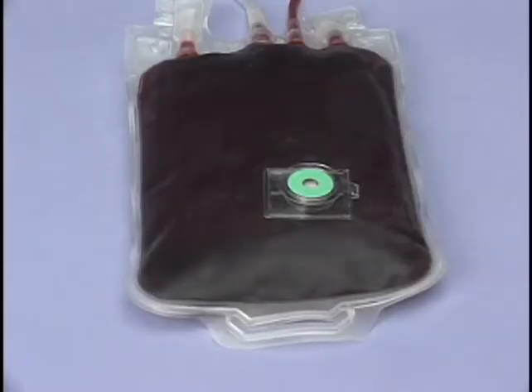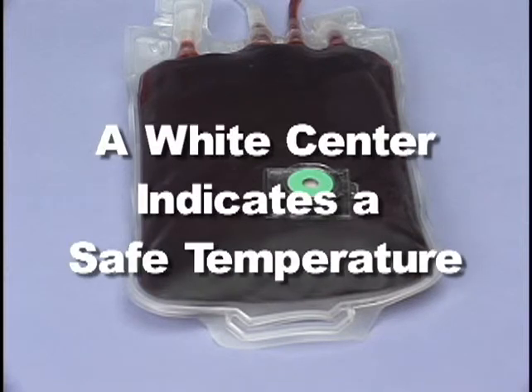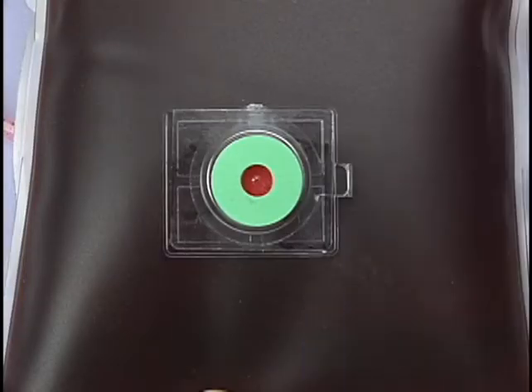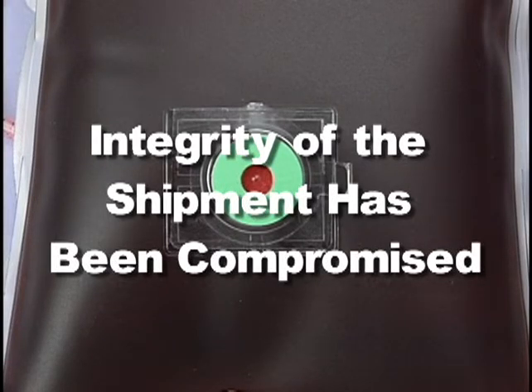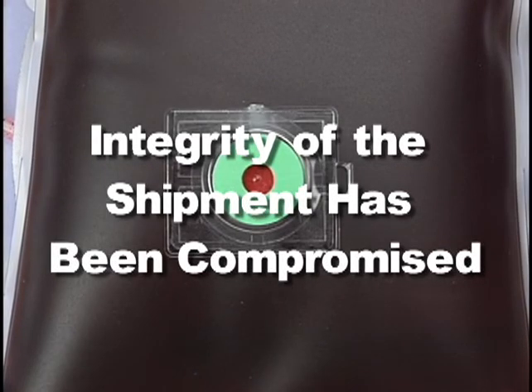When the blood bag is removed from the cooler after transport, a white center on the Safety View indicator indicates that the temperature integrity of the shipment has not been compromised. A red center indicates that the temperature integrity of the shipment has been compromised and the blood should not be reissued.